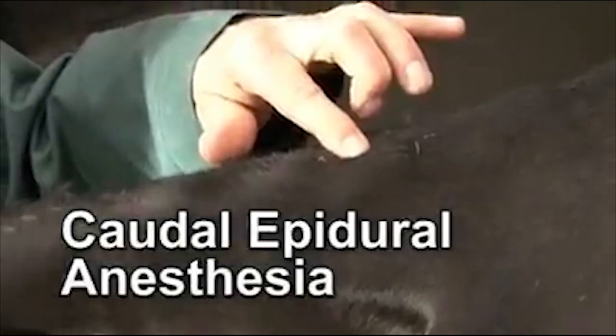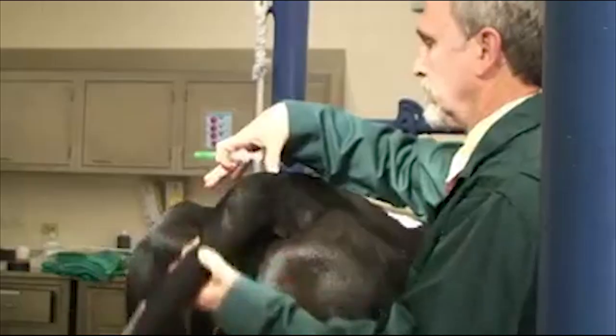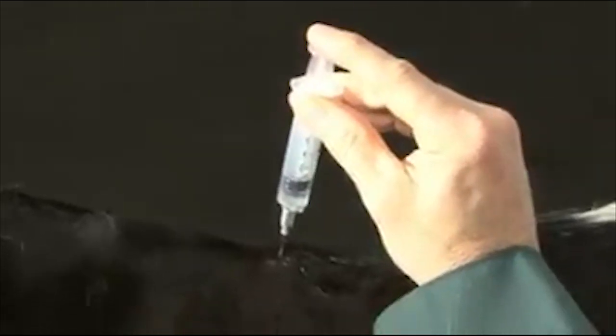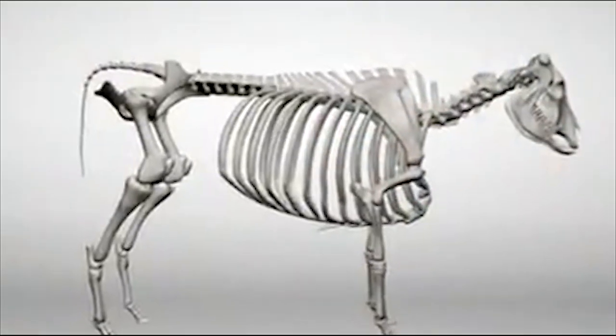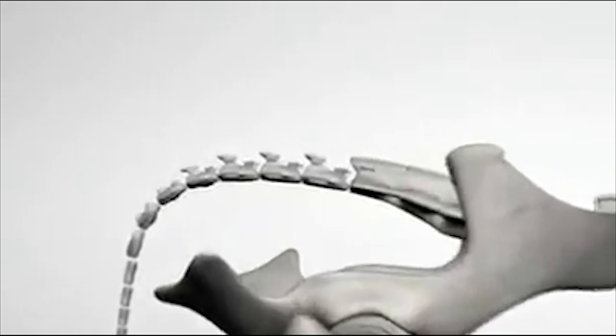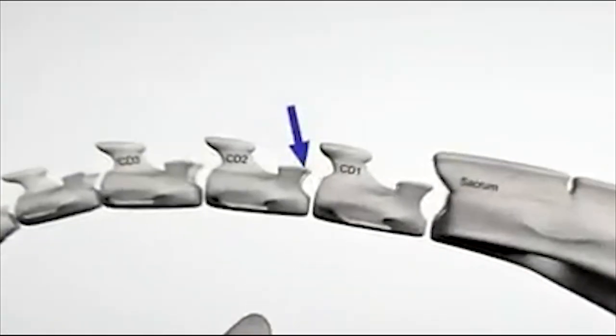Epidural anesthesia can be performed on cattle to provide anesthesia to the caudal body regions for surgical procedures and to block straining and tenesmus. Epidurals are administered in the epidural space between the first and second caudal vertebrae.